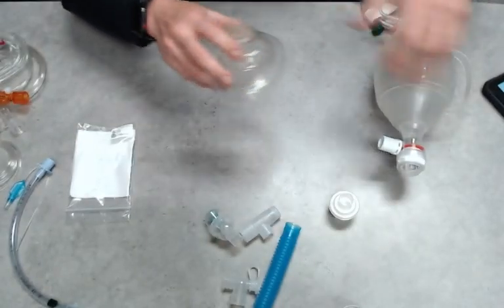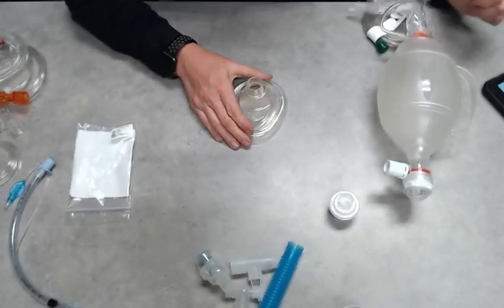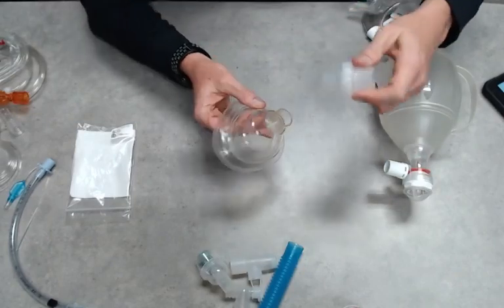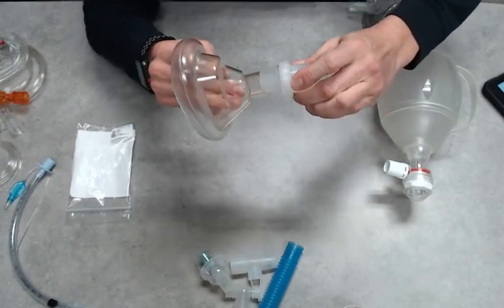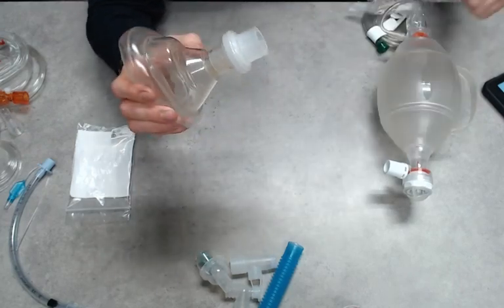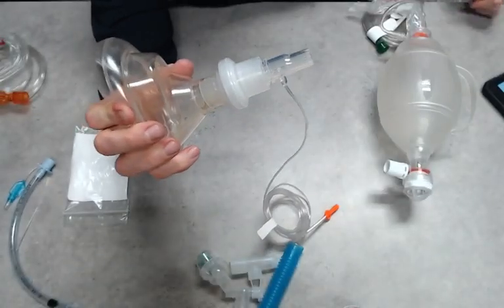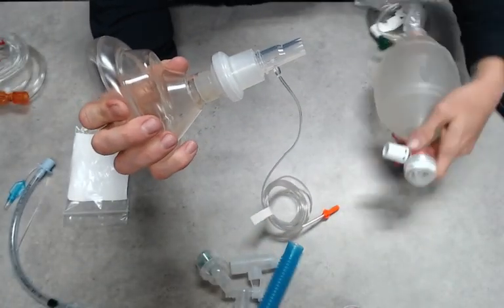So first we're going to start with our BVM mask, and then from here we're going to add our filter. Our filter will plug right into it. It's a little snug at first, but get it pressed in there. And then we're going to add our end-tidal, plugs in just like that, and then we can attach our BVM to the end of this.